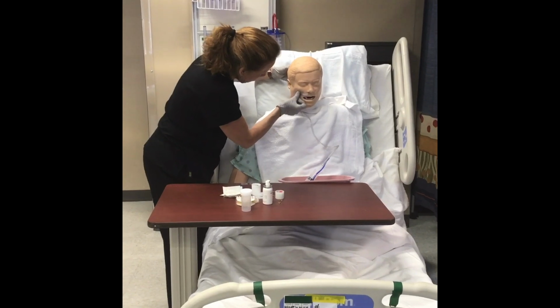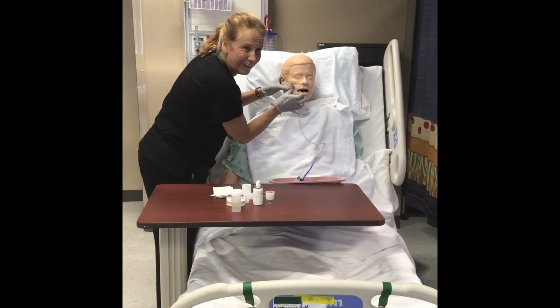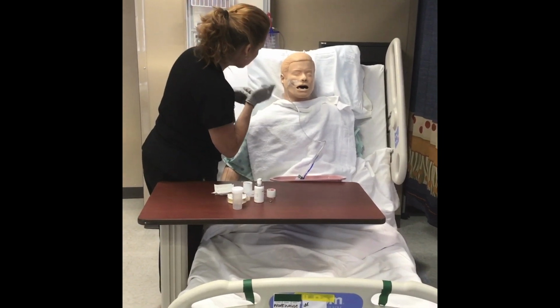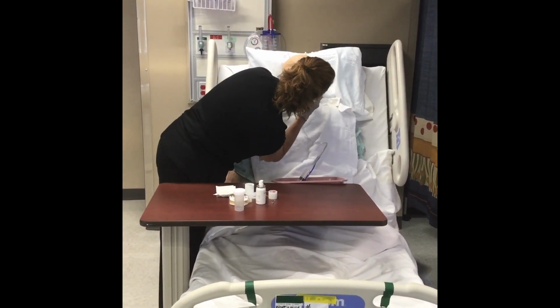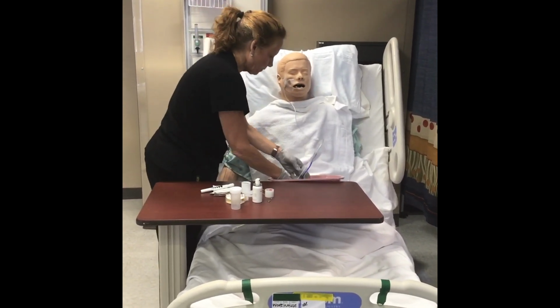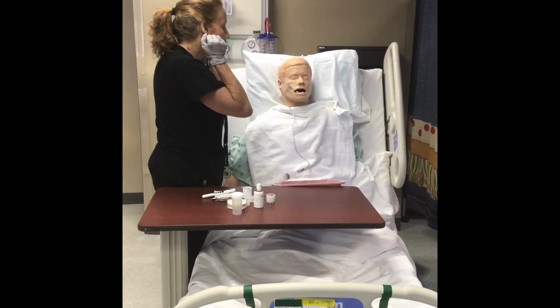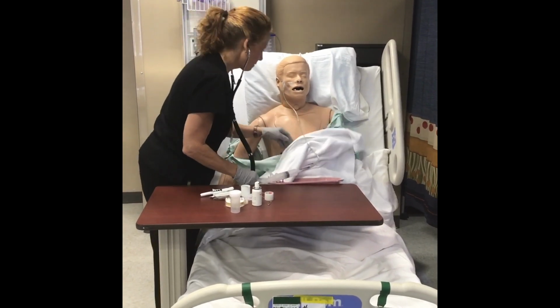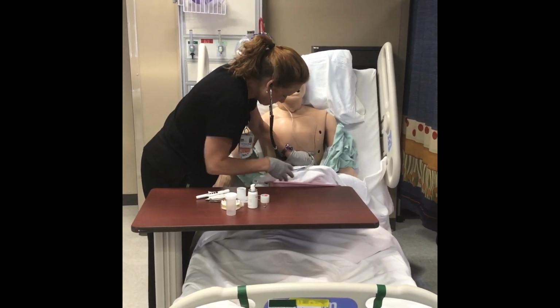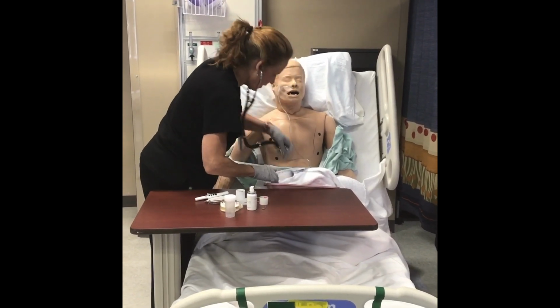Okay. Can I ask you to speak, please? Hello. Now, I'm just going to check inside your throat to see if there's any coiling. Okay, there is no coiling. Next, what I'm going to do is listen to see if I hear an air bolus. Okay, I hear the air bolus.